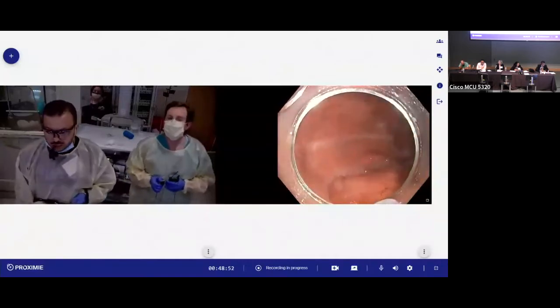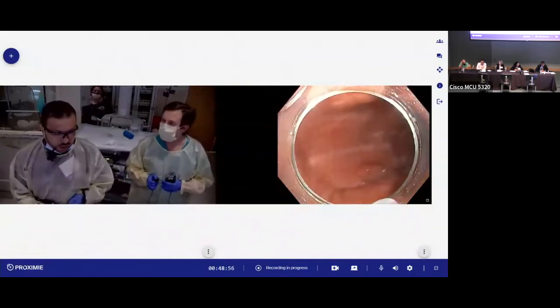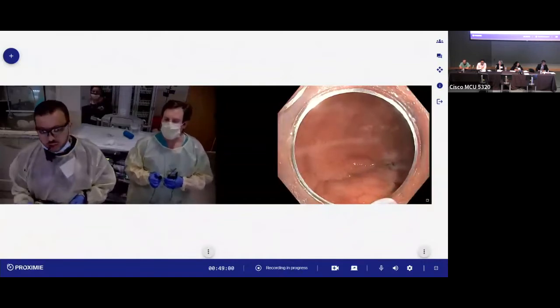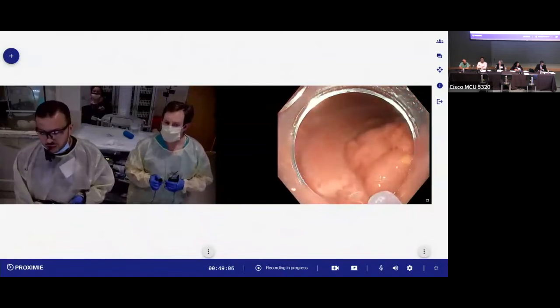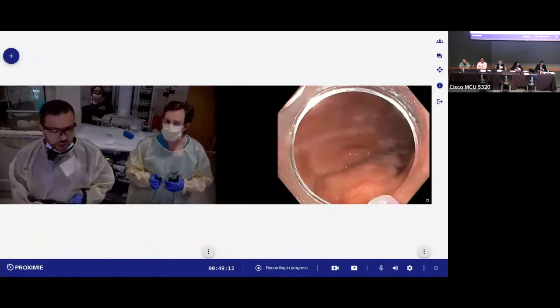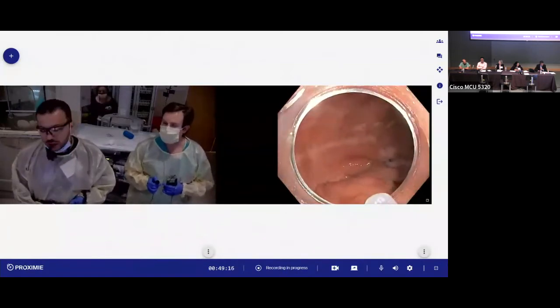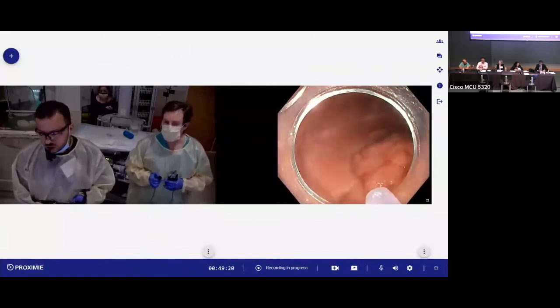One thing that I would ask my colleague to do is not to take extensive biopsies from the lesions if they are thinking about referring this case, not to tattoo under this. And also, if they want to test it for lift, just to check the lift sign, only inject saline and nothing like Orise gel or any other gel substance, because that can cause fibrosis as well and make a future procedure harder.